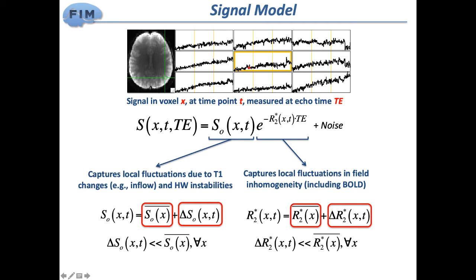And hopefully we will be able to get to having almost just this part, which is the one we care about. That doesn't mean that this part is clean. There might still be some physiological noise in here, but it will definitely be cleaner than when we have the whole thing. That's one way to think about it.